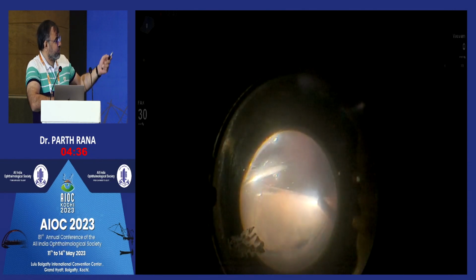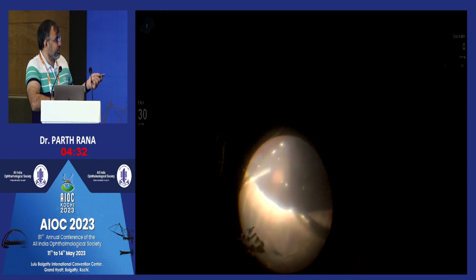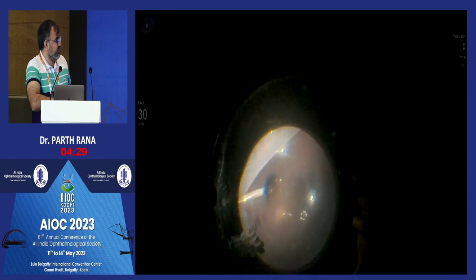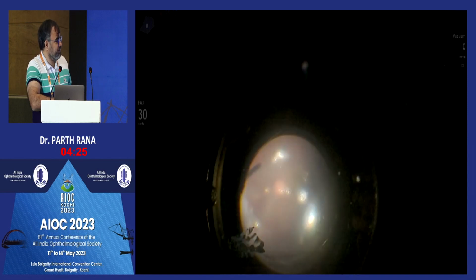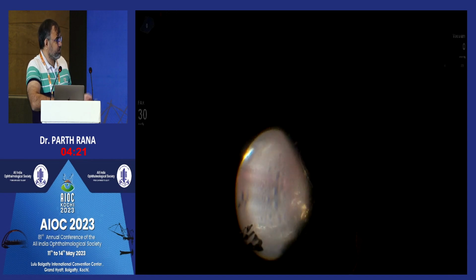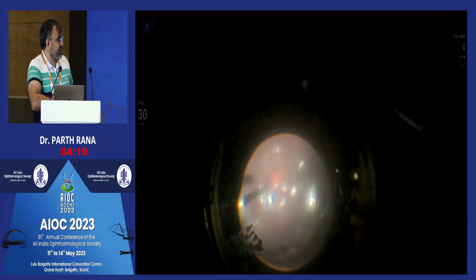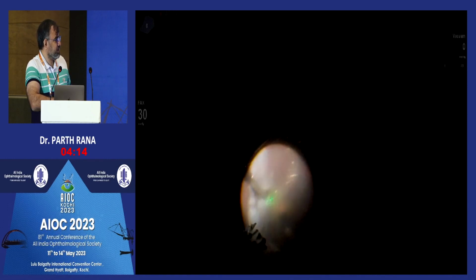Total ballooning was done. So then I put PFCL. Luckily, with the PFCL, this went off, and even one choroidal detachment that was there on the side also went off. Finally, in the end, everything was good, and I did a PFCL silicone oil exchange.